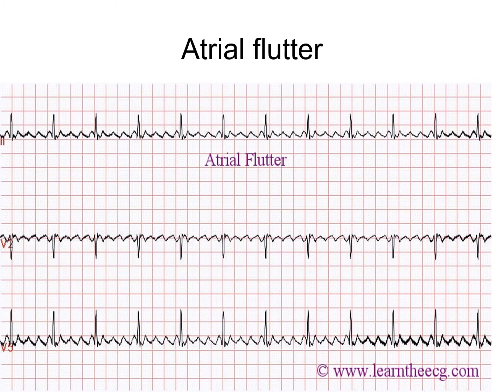Here's another example of what atrial flutter looks like. A lot of times the atrial rate's about 250 to 300. The ventricular rate is variable depending on the slow or fast ventricular response.